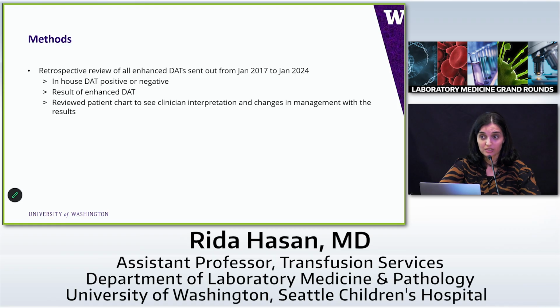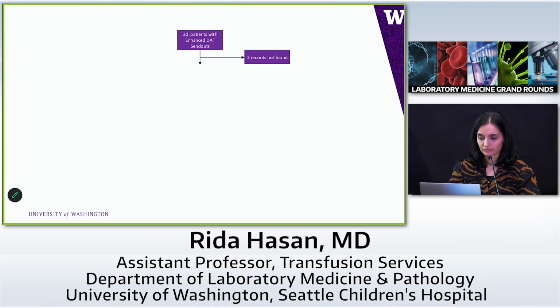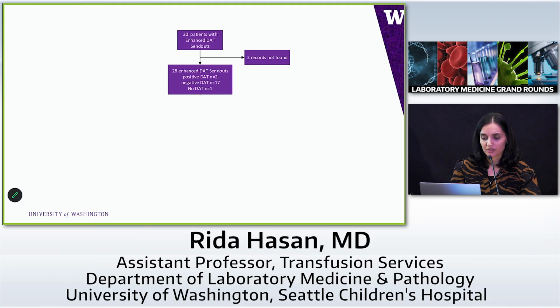Did they follow them up? Did they change their management? Did it actually lead to a diagnosis? So we found that there were 30 patients with enhanced DATs that were sent out, which is actually not too many. And then 2 patients we couldn't locate the records of. So that leaves us with 28 send-outs.